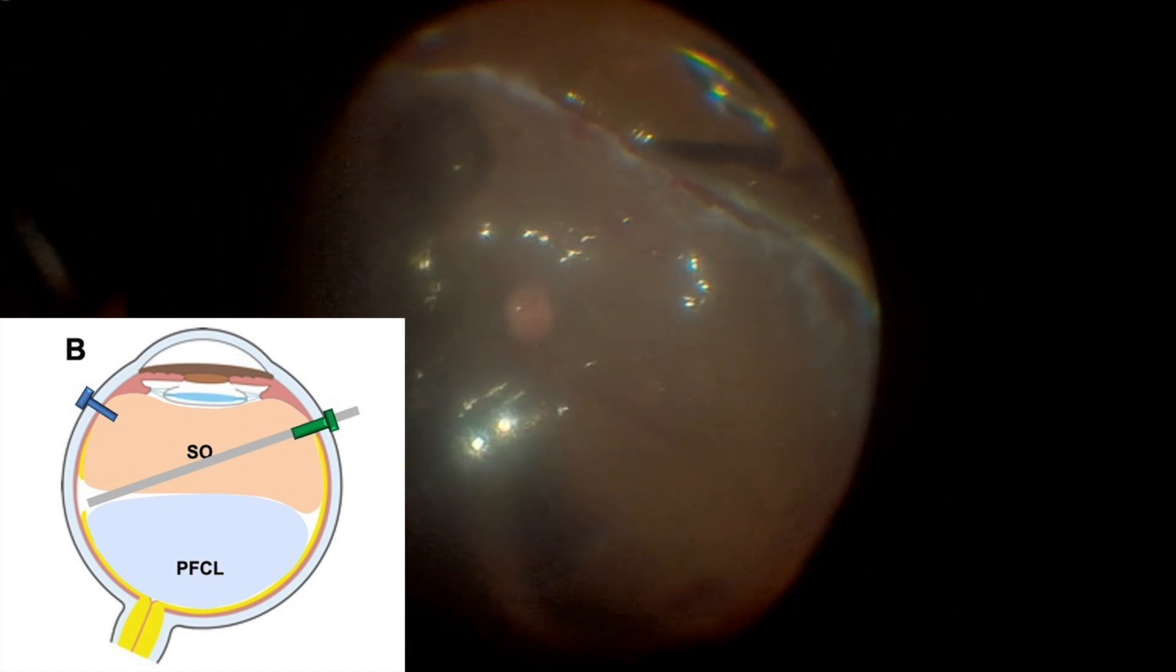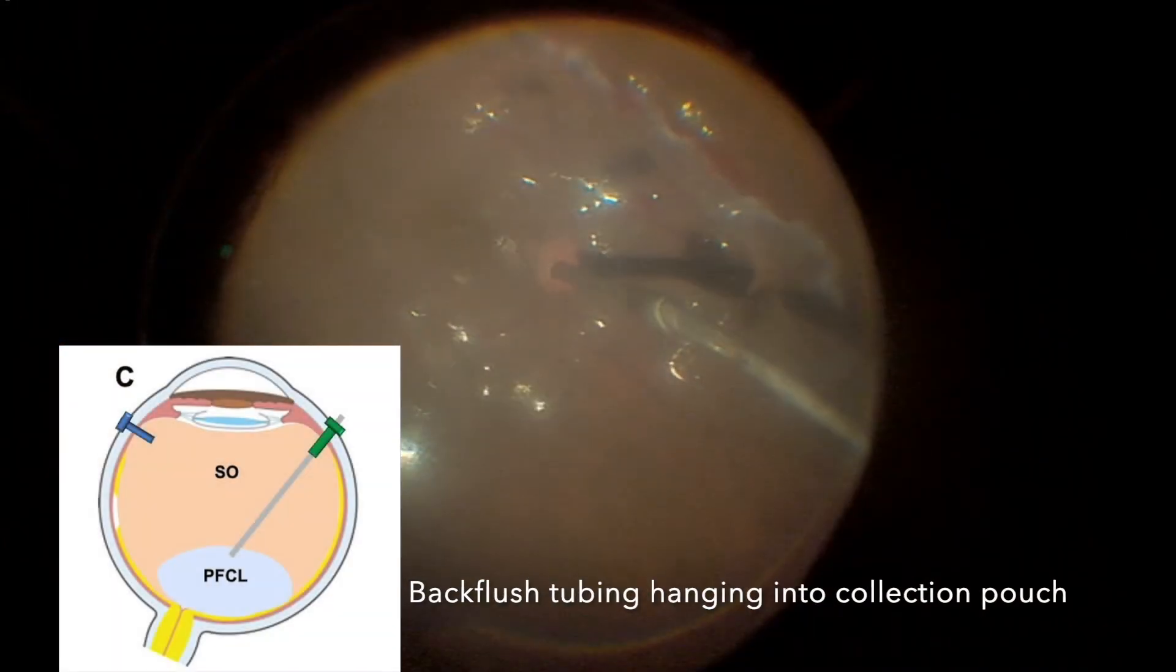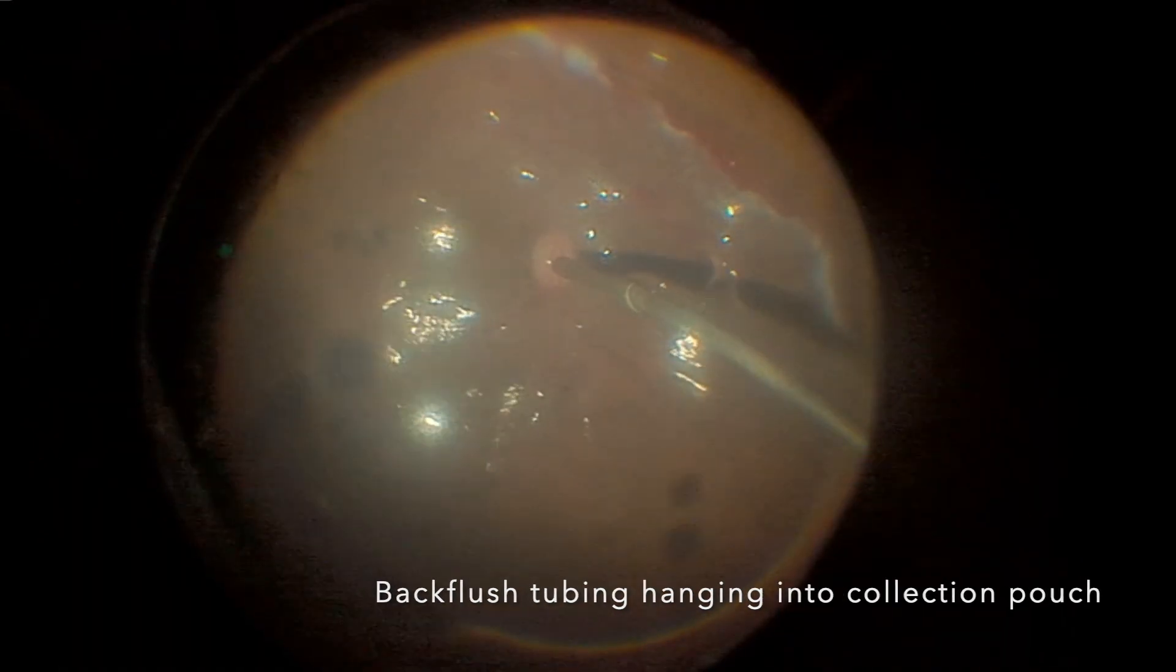If you change from 25 to 20, you have 2 times increased outflow of PFCL. From 25 to 23, 1.5 times increased outflow of PFCL.